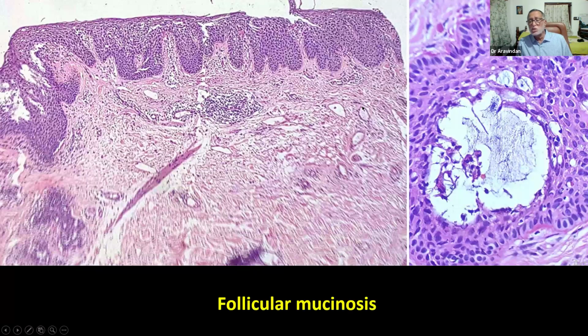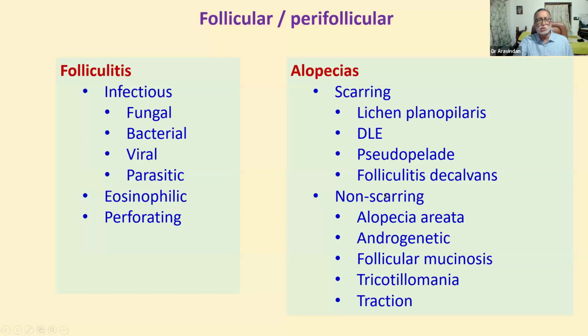And one thing to remember is that follicular mucinosis can sometimes be associated with follicular mycosis fungoides. There may be a heavy lymphoid infiltrate associated with that. Typical epidermotropism, Pautrier's microabscess and typical follicular kind of infiltrate, in which case you will have to do immunohistochemistry to really look for it. In this case, of course, it doesn't seem to be so. So this is a follicular mucinosis.